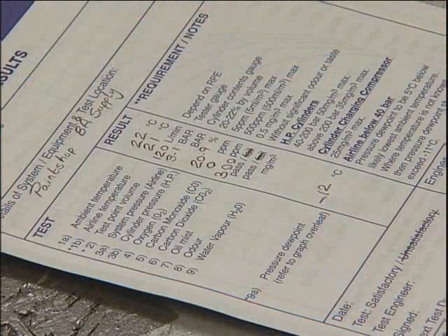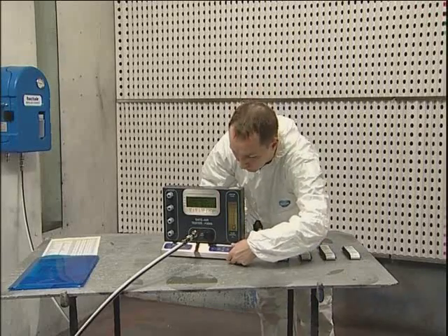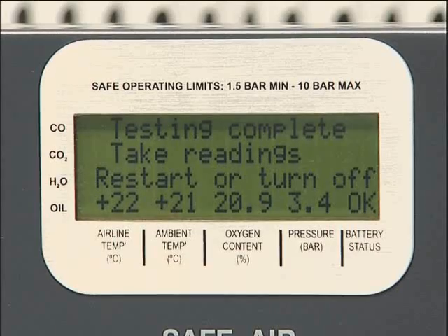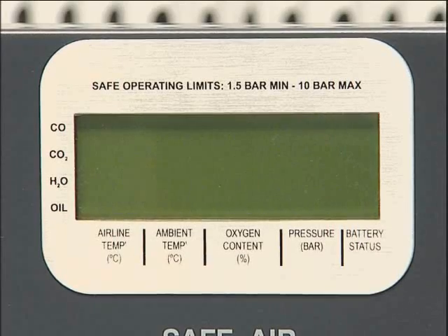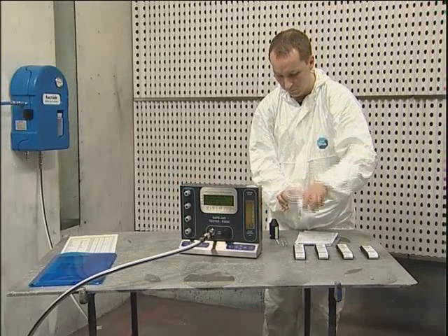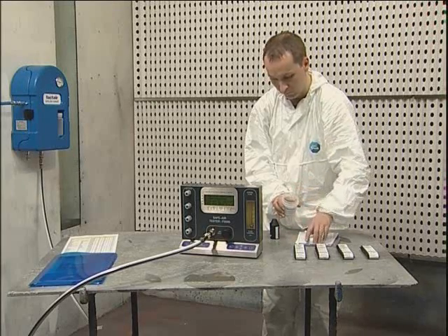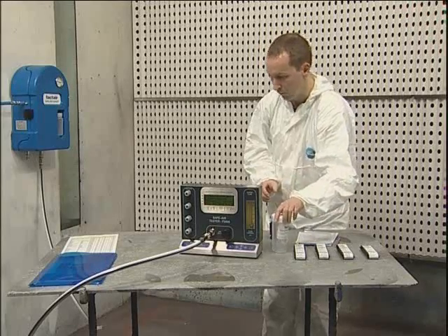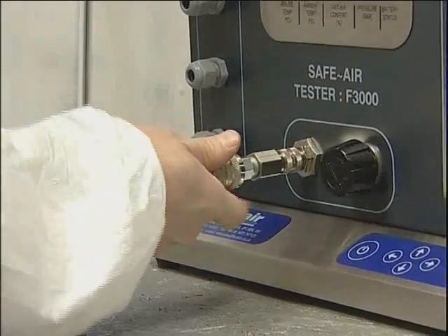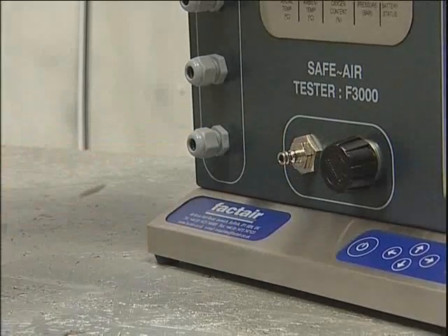When all readings have been logged, the unit can be switched off by pressing and holding the on/off button, or restarted by pressing it briefly if further tests are to be carried out. The tester will automatically switch off after one hour if not used. Records of air quality tests should be kept for five years. Spent tubes should be placed in the container provided for disposal in accordance with the manufacturer's instructions. To disconnect the tester from the system, make sure you leave the inlet adapter on the instrument and only disconnect at the end of the supply hose. The adapter can then be disconnected afterwards if required.